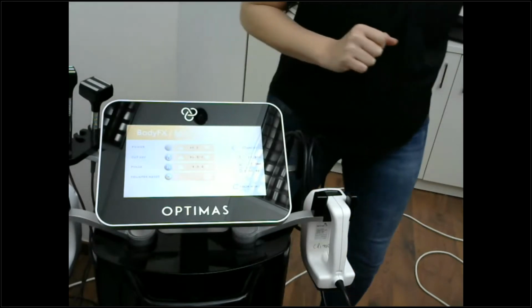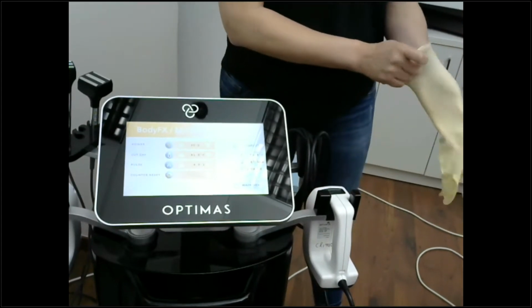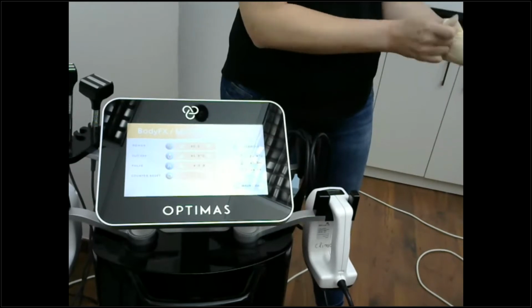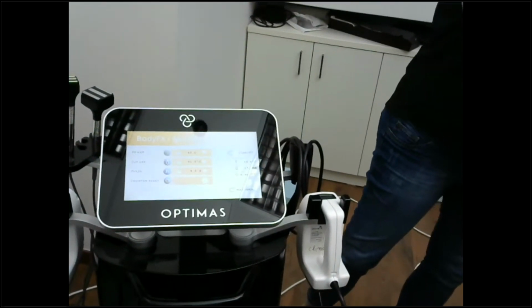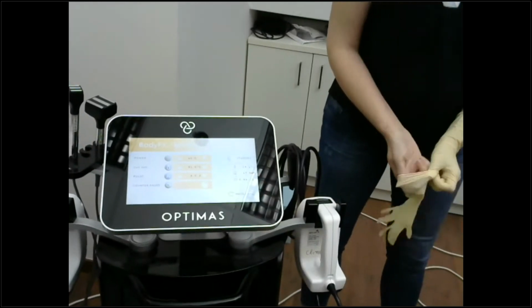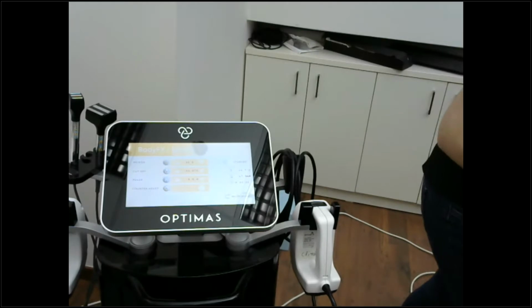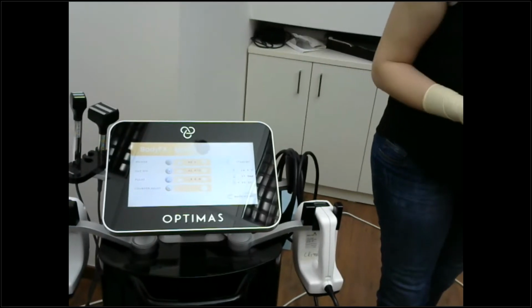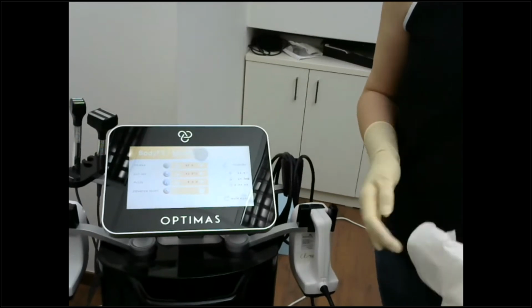We talked about the fact that we are marking our patients on a standing patient, which I will not demonstrate now, so you'll have to forgive me. And we've talked about the size of the treatment area. Okay, so the size of the treatment area, as we said earlier, we're talking about 4 to 6 times the size of the chamber.